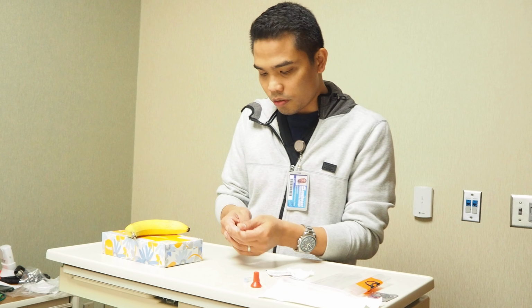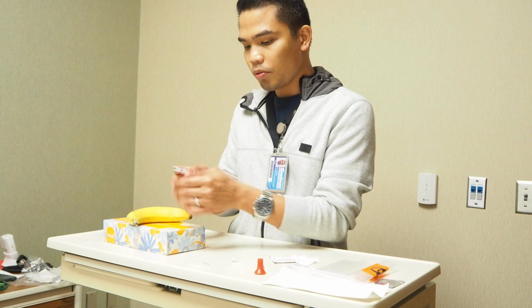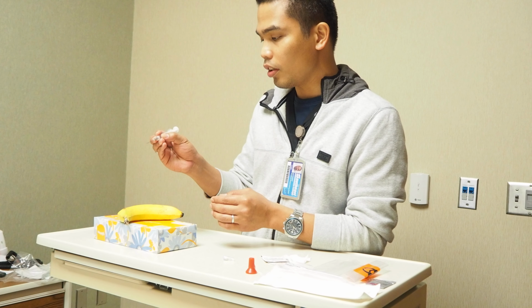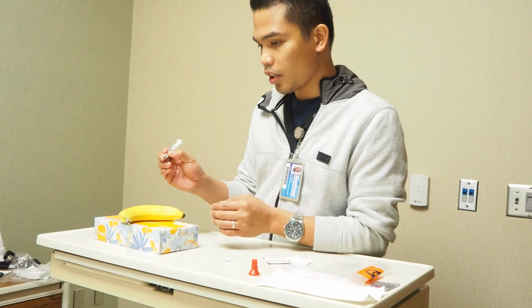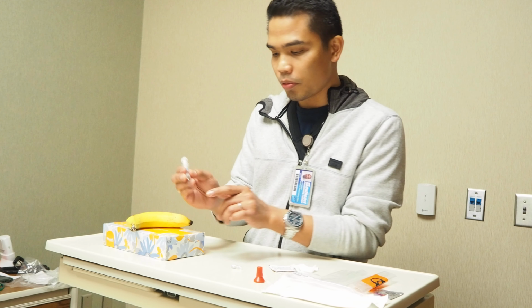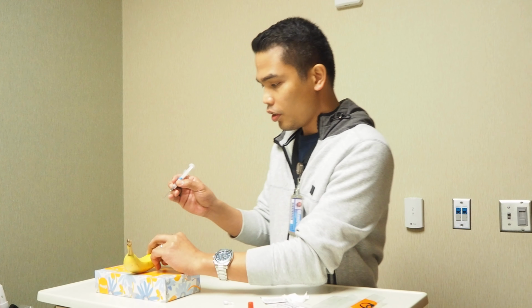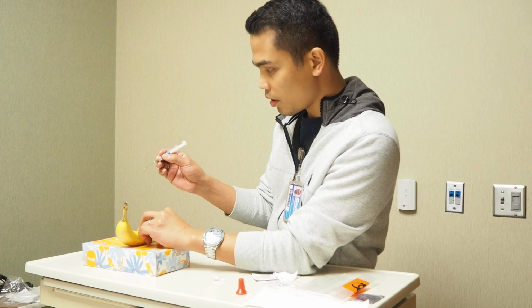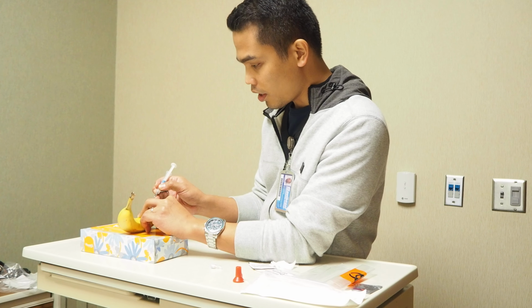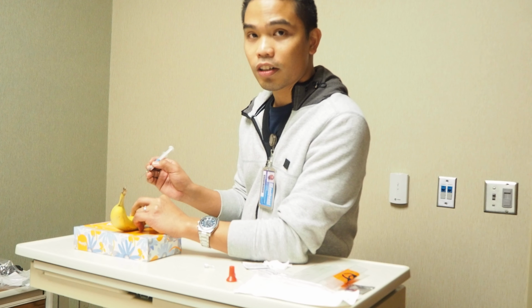After that, I'm going to prepare the needle and remove the cap, and when I position this one, it should be at a 45-degree angle. When I hold the needle, it should be like you're holding a pencil or a pen, like this. Prior to inserting it, the needle should be positioned like this, bevel up. As you noticed, I'm positioning my hand at a 45-degree angle, holding it like a pencil, and I palpate the artery well until I sense that I can push it through.